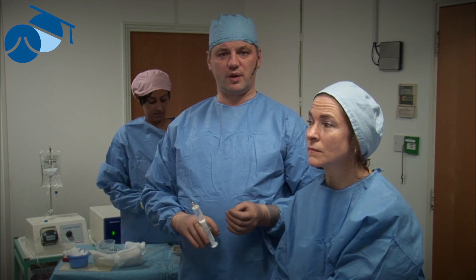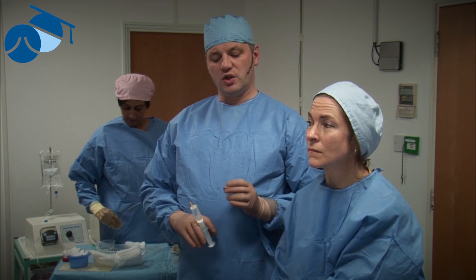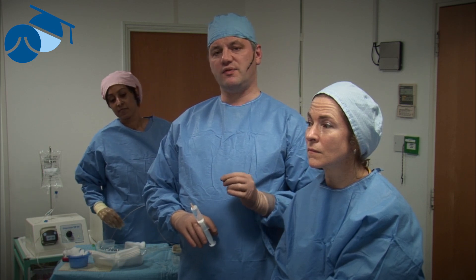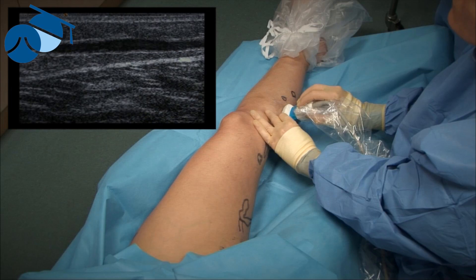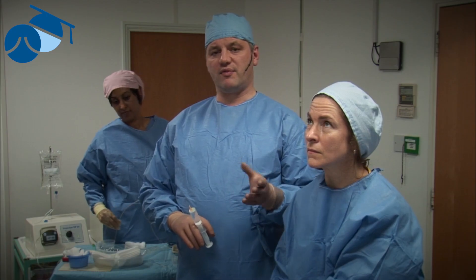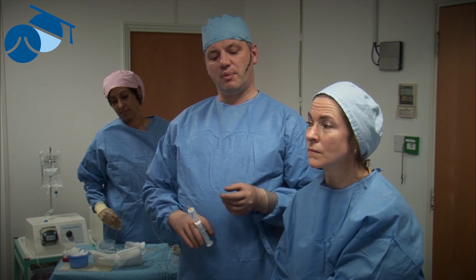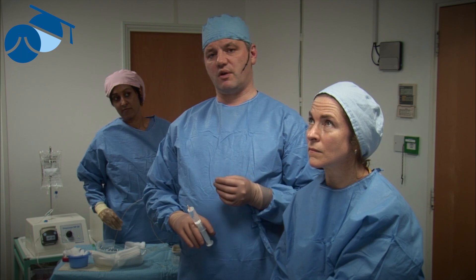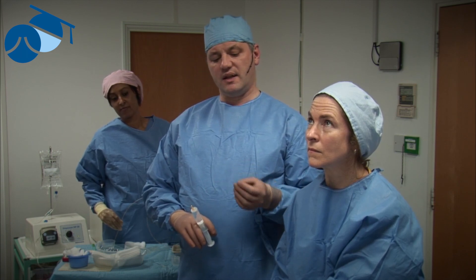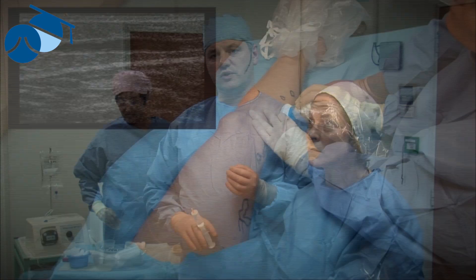We're going into a complex set of recurrent varicose veins. This lady previously had a failed strip and is missing the majority of her great saphenous vein in the thigh. We're going to show how we can use endovenous radiofrequency ablation in the distal great saphenous vein up to that point, followed by endovenous radiofrequency ablation above that, to ablate both the reflux at the top and the reflux at the bottom. In the middle part we could either perform foam sclerotherapy or phlebectomies — in this case the veins are too large for foam sclerotherapy, so we'll be going with phlebectomy.